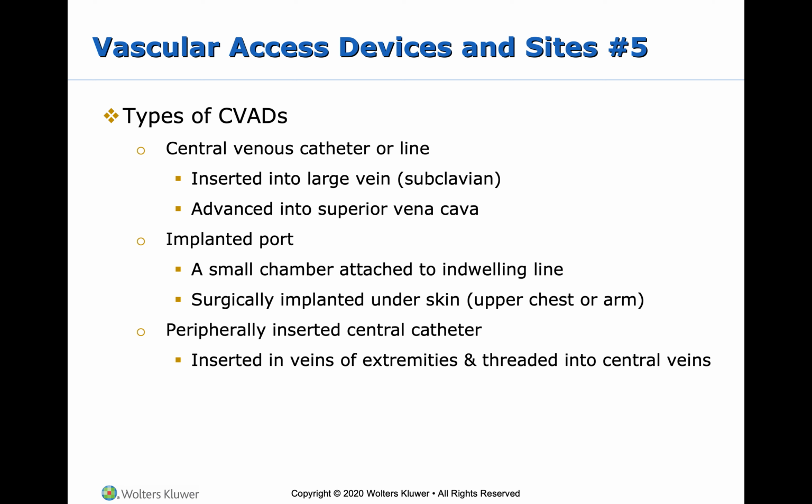Then you're going to give them another syringe and they're going to draw back whatever amount of blood you need. So how are you going to know how much blood you need when they're drawing from this line? Because they're going to ask you, what do you need? How many cc's? So cc is equivalent to a milliliter, okay? And on each of your tubes, it tells you how many milliliters are in each tube.